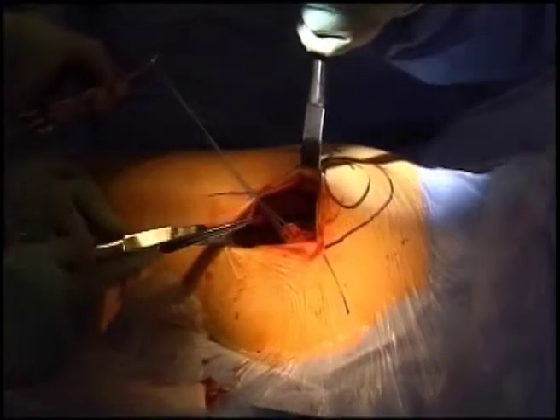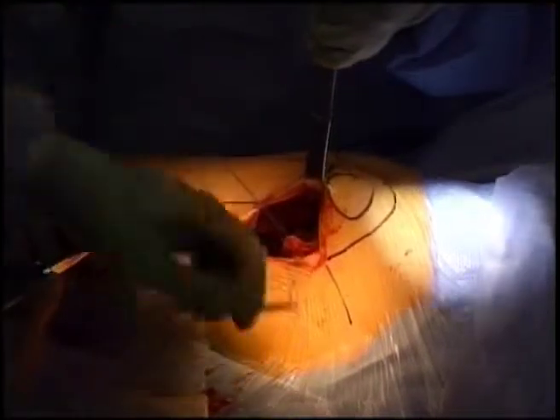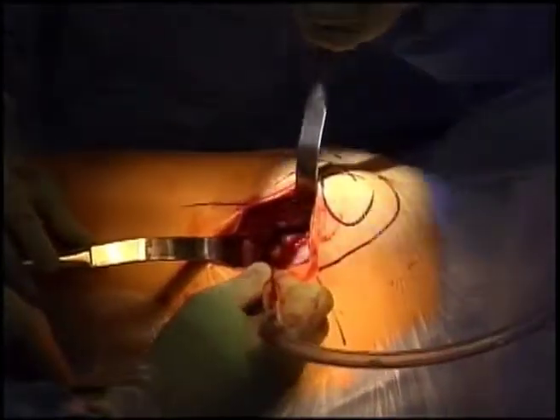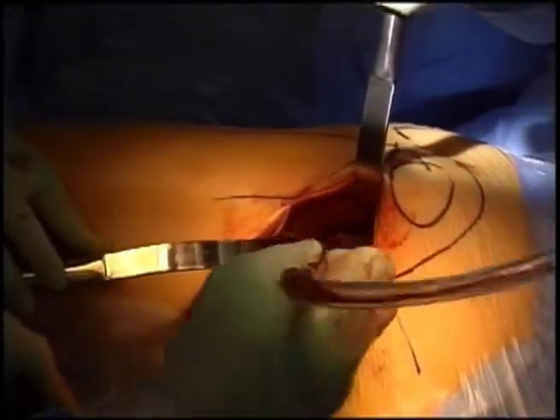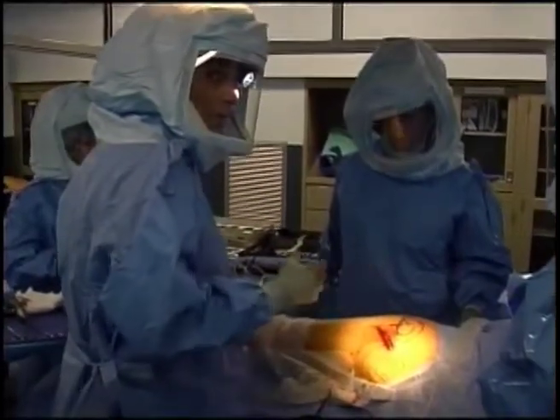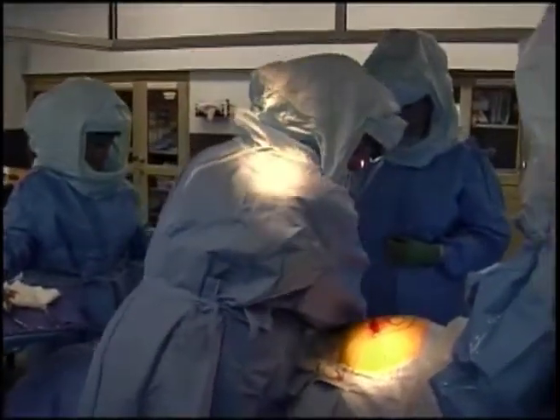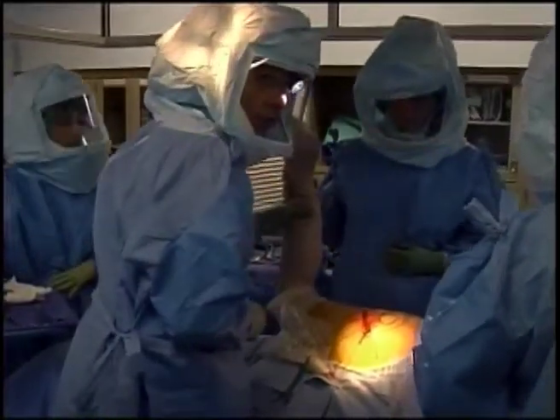We've completed taking down the tendons and the lining of the hip joint or the capsule. This suture is around the tendons, which we will repair later, and this is around the capsule of the hip joint. Deep inside underneath the capsule, you can see the ball of the hip, which we will now pop out of the socket or dislocate. To do that, the patient's hip is bent up and the knee is pushed toward the floor, and as the leg is turned, the hip pops out of place, allowing us to remove the arthritic hip ball.